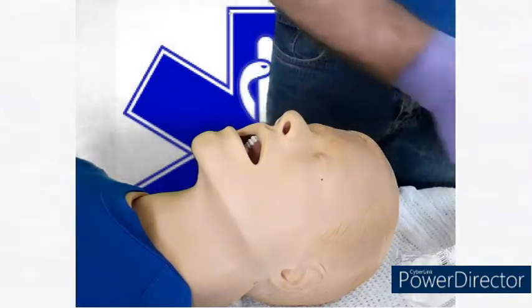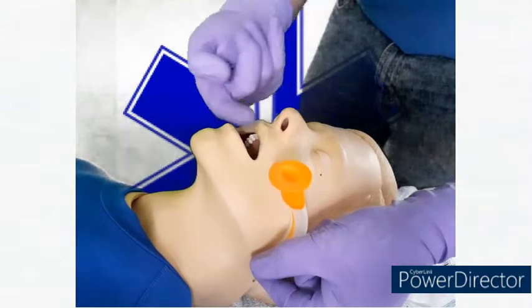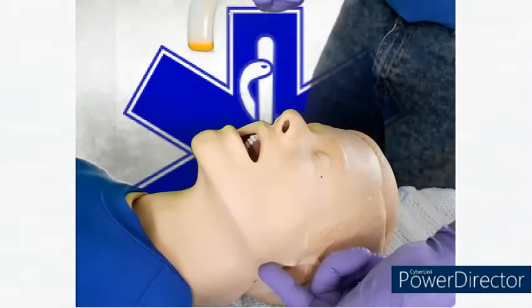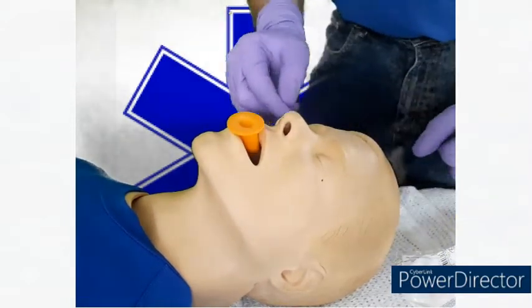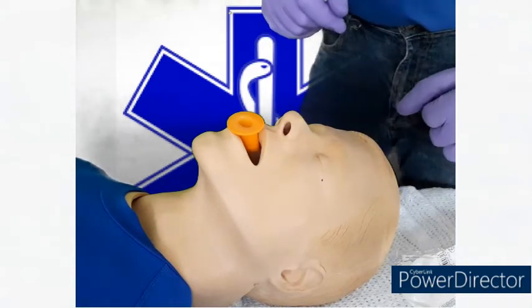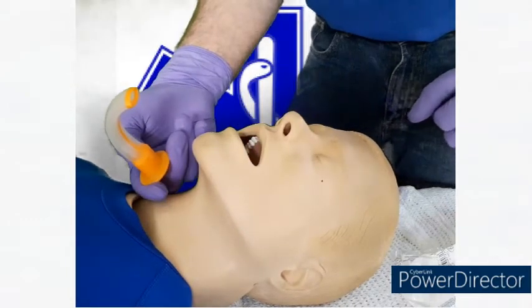So I'll just show you again, this time not using the packet. So I've measured my OPA, I've got the correct size, take it out of the packaging. I'm then going to invert, insert, rotate, locate. And what you'll notice is, as I rotate, it goes down and round like a corkscrew. If they gag on it, it rolls out forward.